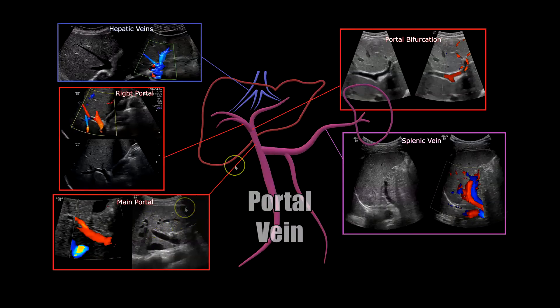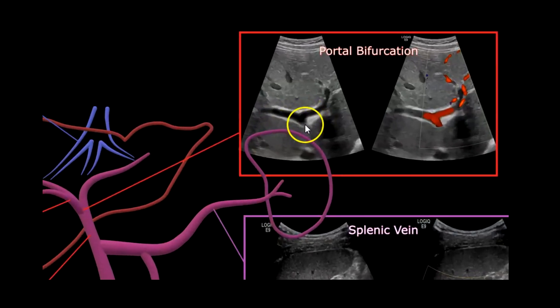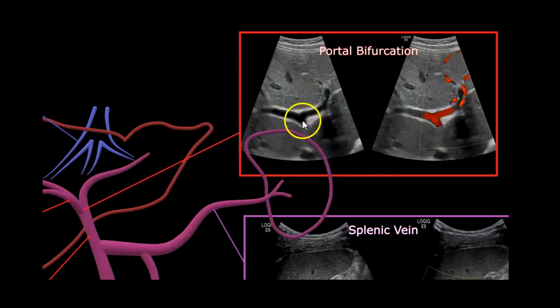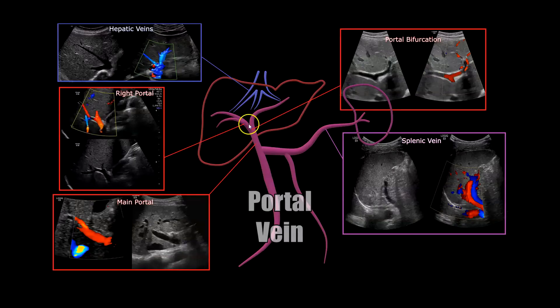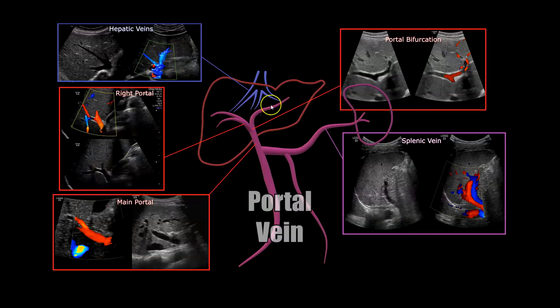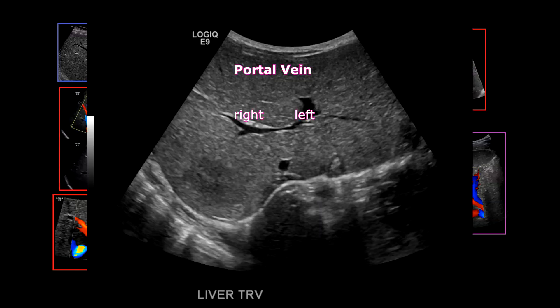The main portal vein bifurcates into right and left portal veins. Here's your bifurcation, and this image shows the portal vein bifurcating into right and left — and that's the same view with color Doppler. The right bifurcates into anterior and posterior segments. You can also get this in transverse oblique, where you'll see the right portal vein bifurcating.